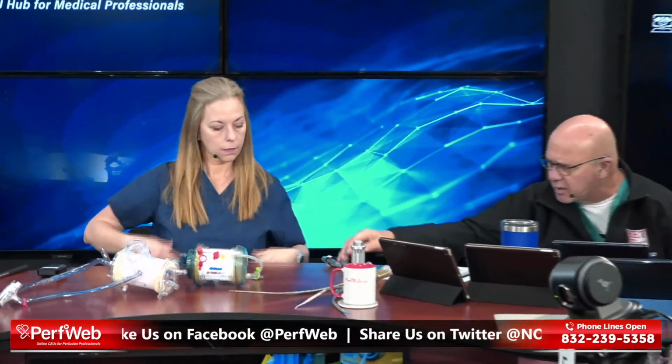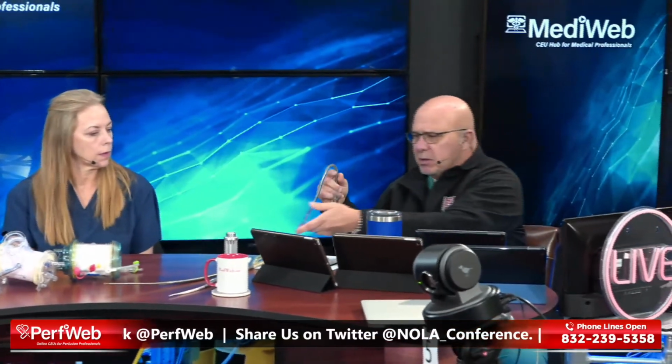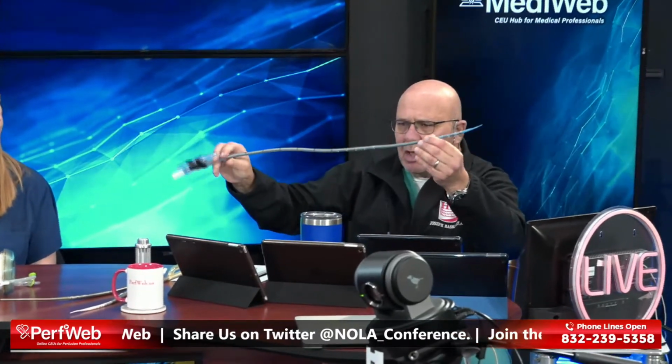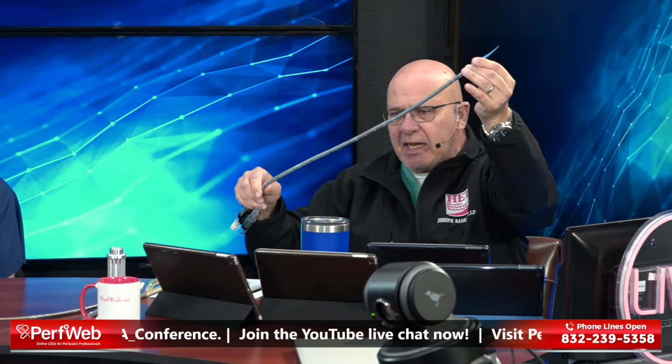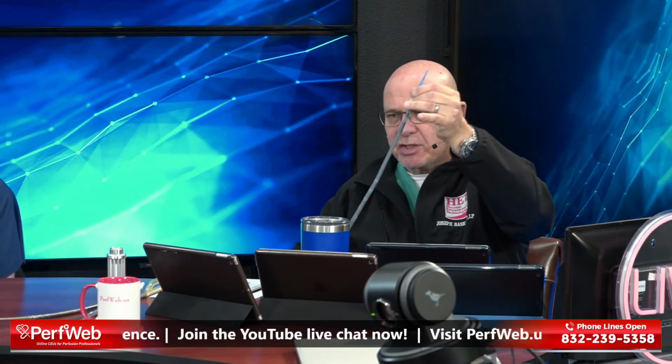So I'm going to go over cannulas very quickly with everyone. This is a traditional, what we call a VFEM, which is a multi-stage single cannula for draining, and this usually is going to be inserted into the femoral vein and then up with the tip.